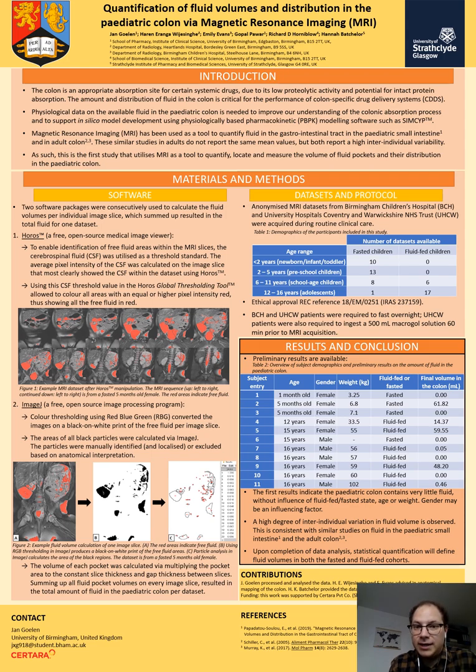For the patients that are fluid-fed, we sometimes can see a nice trail of fluid pockets, so we know these are located in the small intestine as the patient just drank half a liter. However, some other areas are more challenging, so we have expert radiologists on board that help us with mapping out the colon. So after obtaining the area of the black zones, we calculate the volume of the representative fluid pockets by multiplying the area by the slice thickness and distance between MRI slices, so we account for the inter-slice gap. This gives us the volume of each fluid pocket. The total fluid volumes on all slices gives us a total volume of fluid in the colon per dataset.